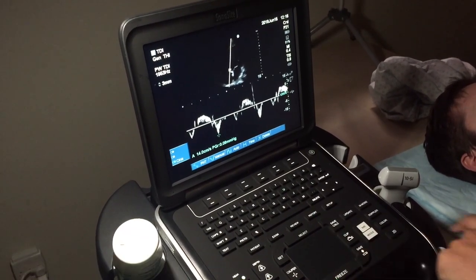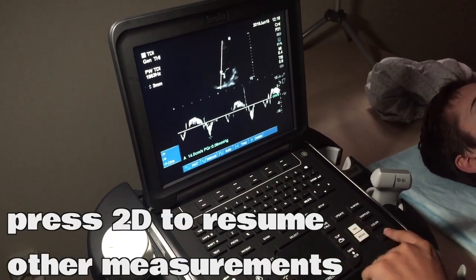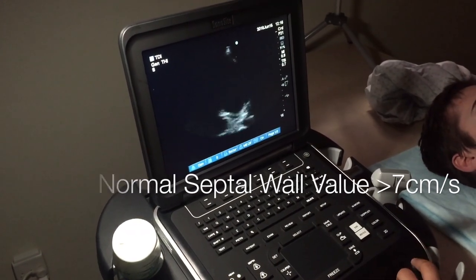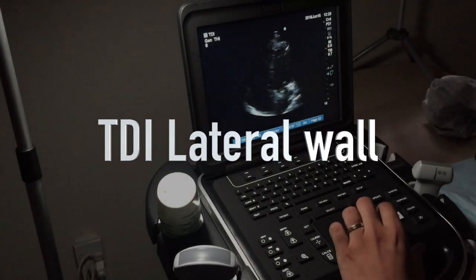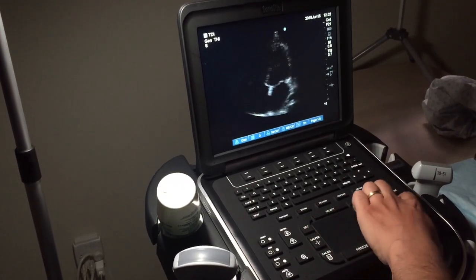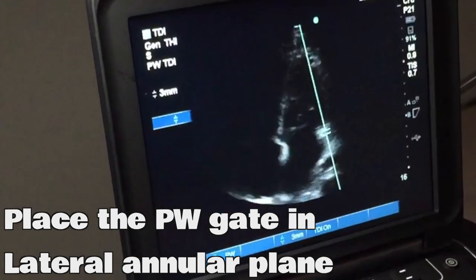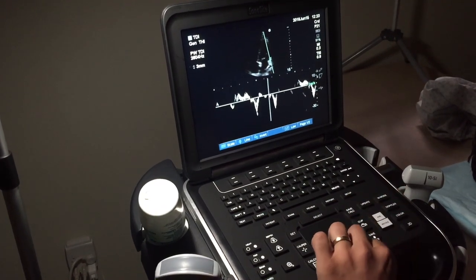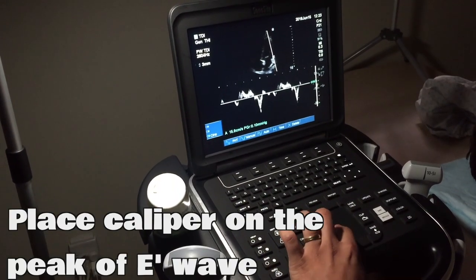A normal tissue velocity for the septal wall should be greater than 7 centimeters per second. Remember that you need to be in the apical four-chamber view. Place the caliper on the wall at the point that is in line with the mitral annular plane, then repeat the same steps done previously to record a velocity. A normal tissue velocity for the lateral wall should be greater than 9 centimeters per second.